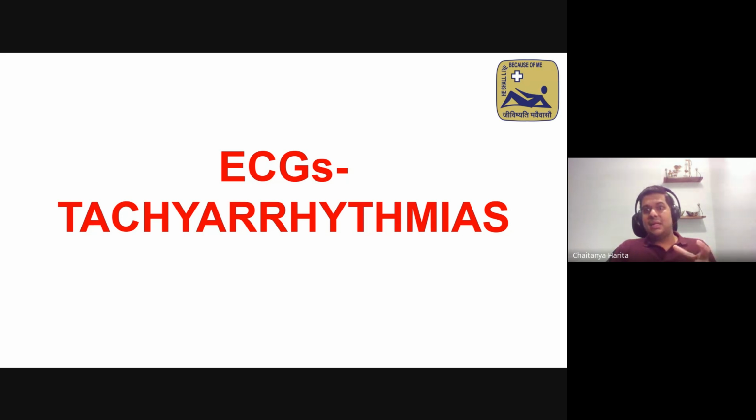So they'll send me and say, sir, I thought this was MI, I loaded and sent the patient, but he's come back where the cardiologist said he's absolutely normal. Doesn't matter. This is how we all learn. You have erred on the side of caution, which is okay. You saw ST elevation, he came to you with chest pain, you referred. But remember, up to 2.5 mm is okay in a young patient, right? Repeat an ECG and look for it. Remember, when in doubt, an ECG is a dynamic indicator. So always repeat an ECG if you're in doubt. Never hesitate to do more than one ECG.